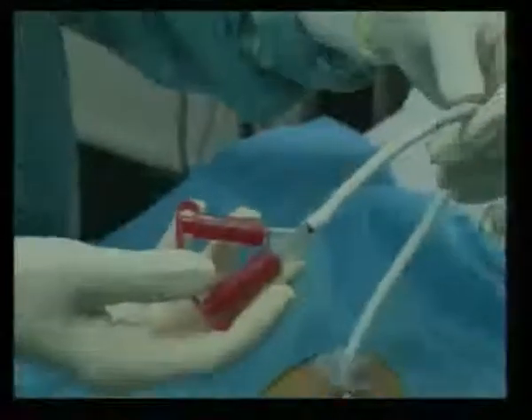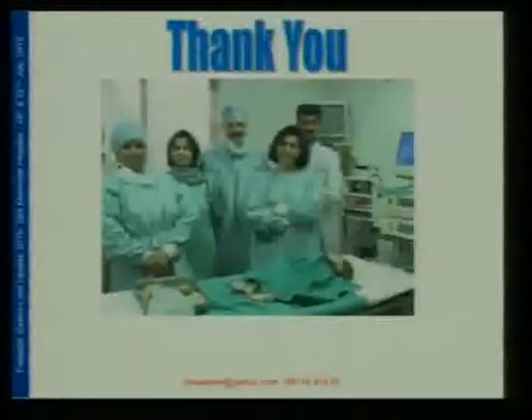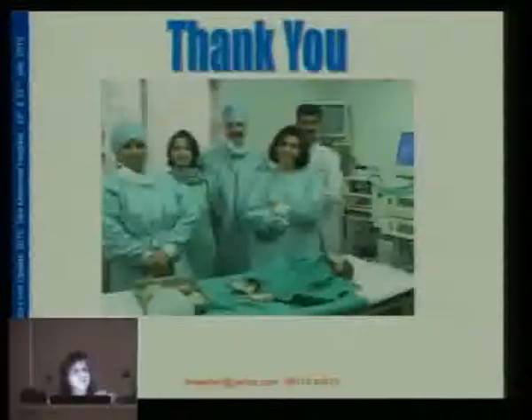You now have very smart ones, like the small ones. This is the first time we get a balloon replacement tube. Balloon replacement is not so small. There are very small ones as well. So life has become quite easy with the help of PEGs and the button replacement, especially for patients who are neurologically handicapped. Thank you so much for your attention.